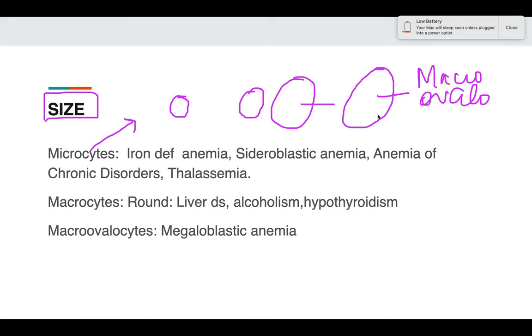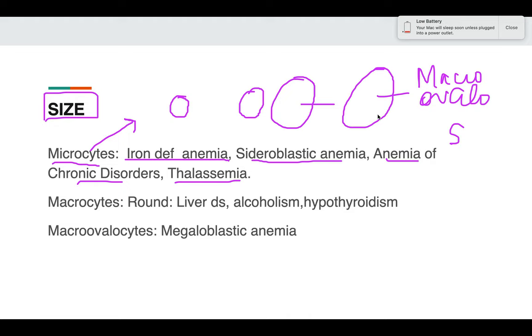Microcytes are seen mainly in iron deficiency anemia, which presents as microcytic hypochromic anemia. They are also seen in sideroblastic anemia, anemia of chronic disorders, and thalassemia. To remember these, you can use the mnemonic SITA: S for sideroblastic anemia, I for iron deficiency anemia, T for thalassemia, and A for anemia of chronic disorders.